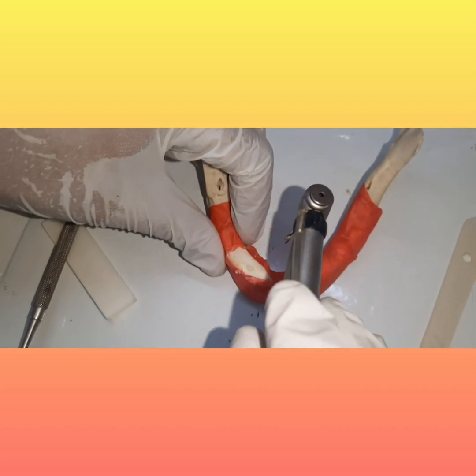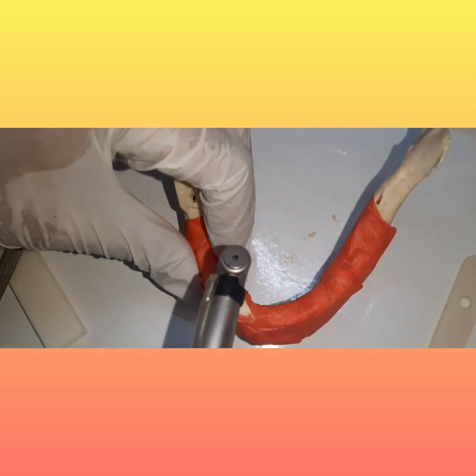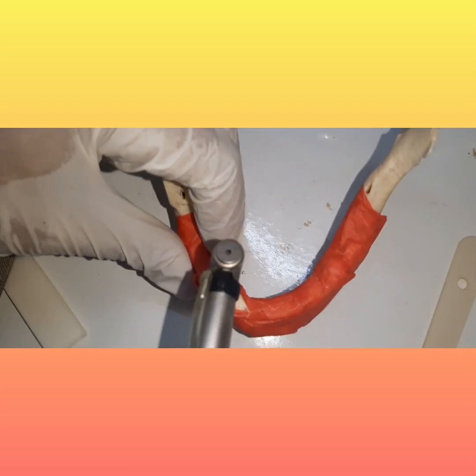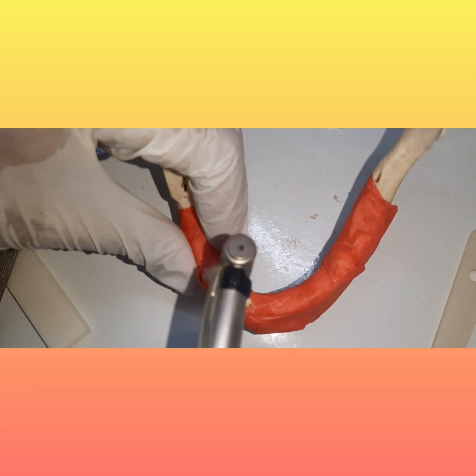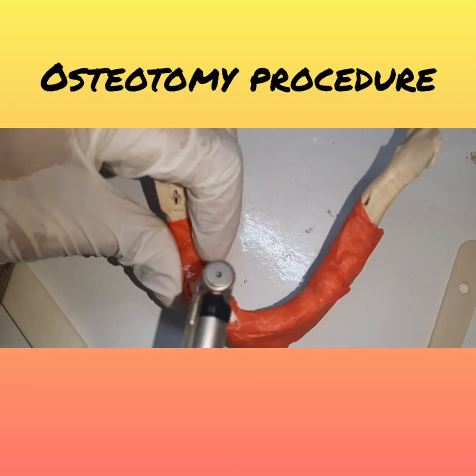So this is how the drill is. And the first thing, you will go to the place where you have placed the purchase point. So with the pilot drill I'm going in.